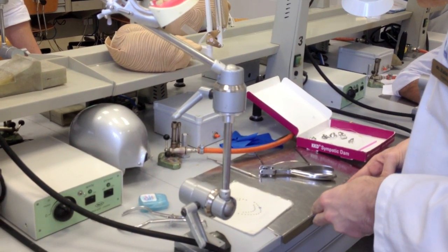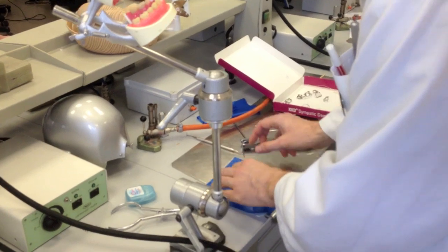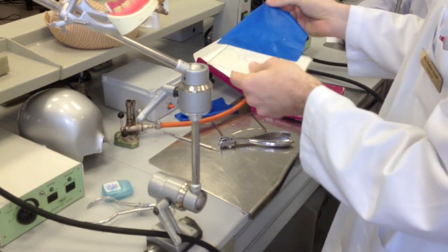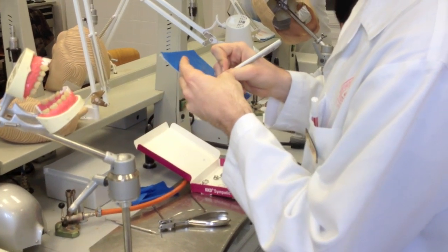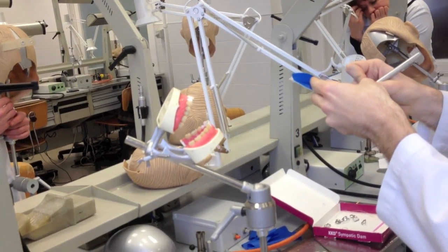For the first case, we want to place the clamp on the lower six and the two neighbors. First, mark it through the template — then seven, six, and the five.